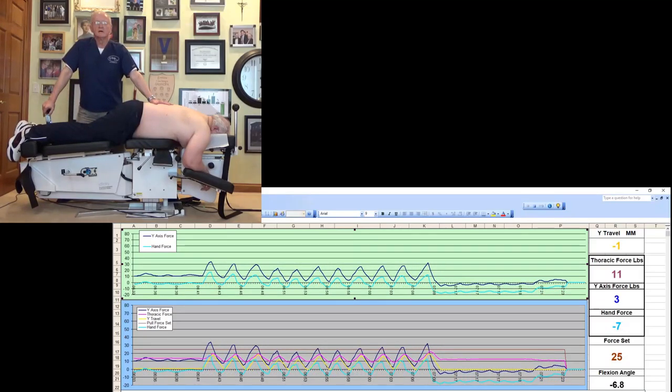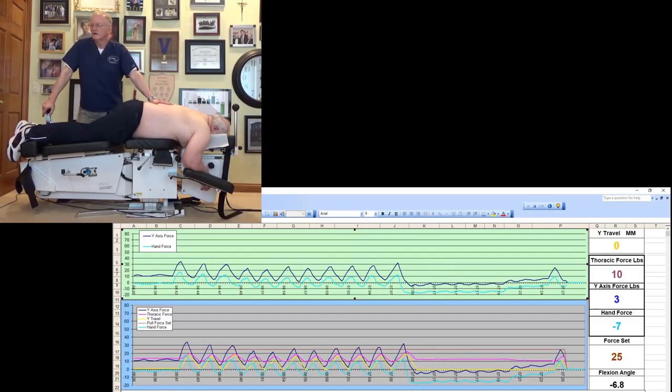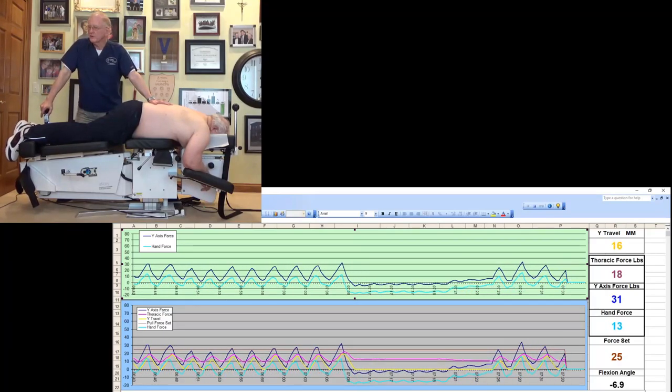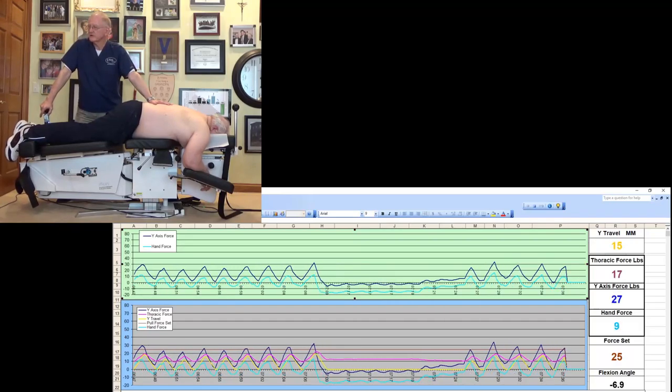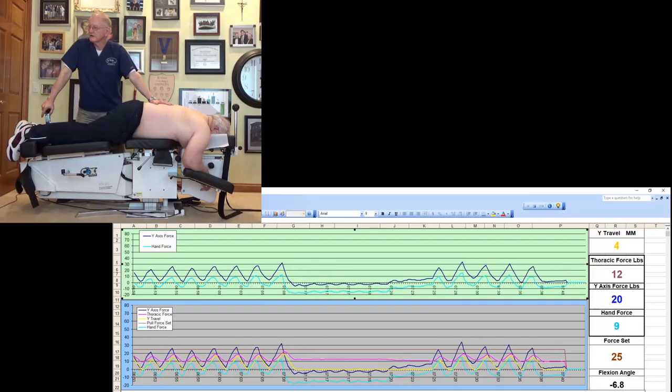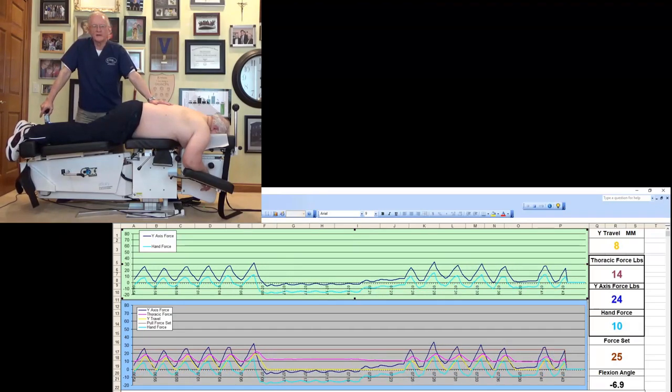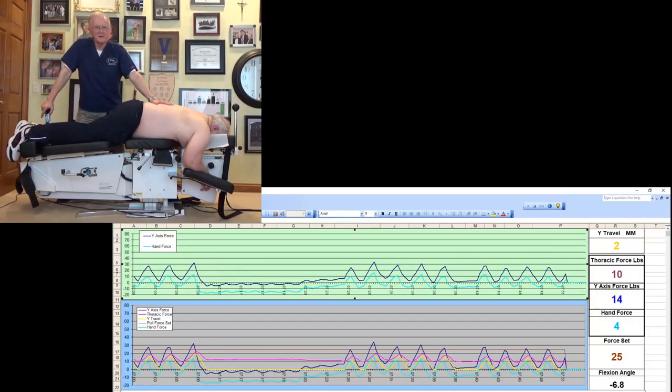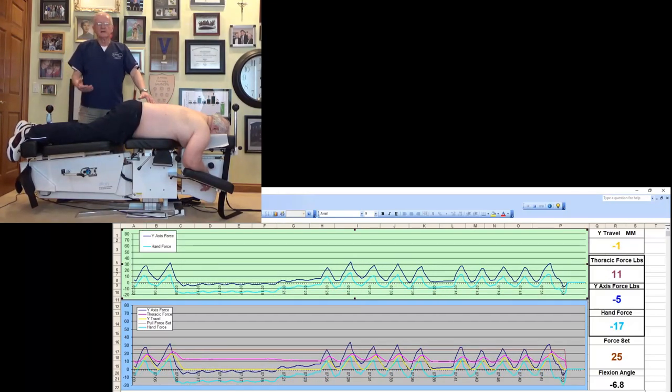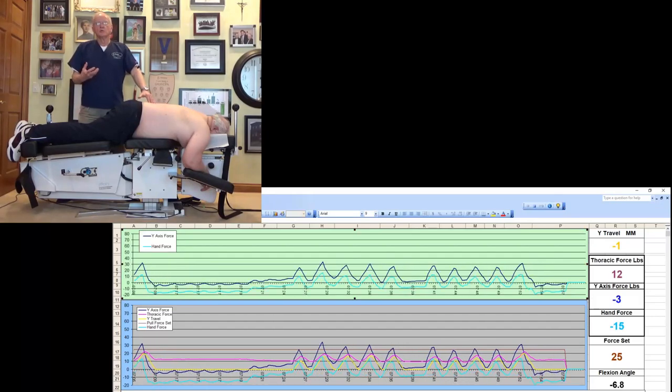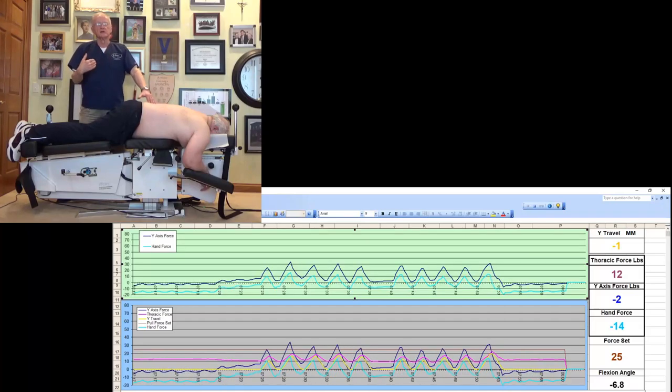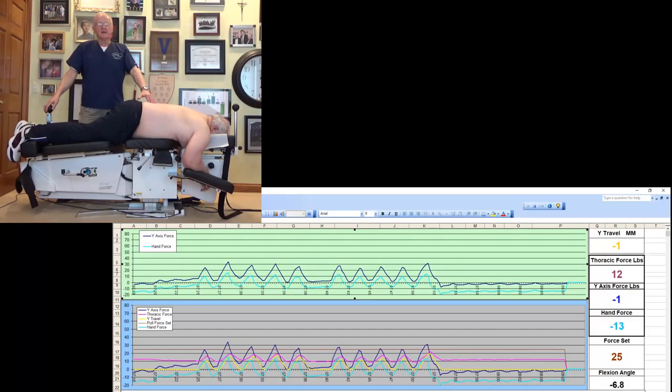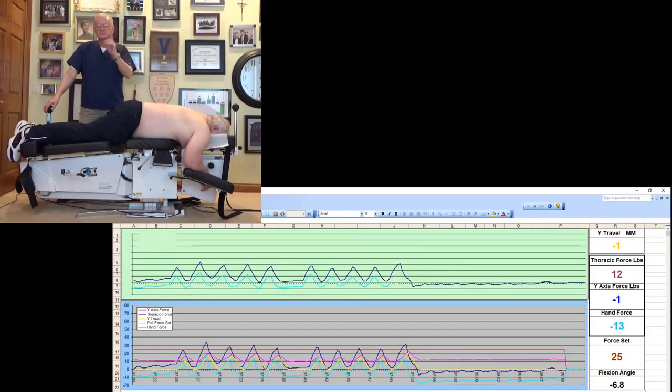When you do it, however, very slow, very gentle, realizing that we're applying much more distraction with the automated force than we are manually. For example, here, if I start here at two, I'm going almost at 20. I'm applying much more force automated than I am manually. I hope that you follow that. The patient will show relief with more force, but first make sure that you have manually started, that you have applied from two up to eight pounds, and then move to automated distraction. So let me just review finally.